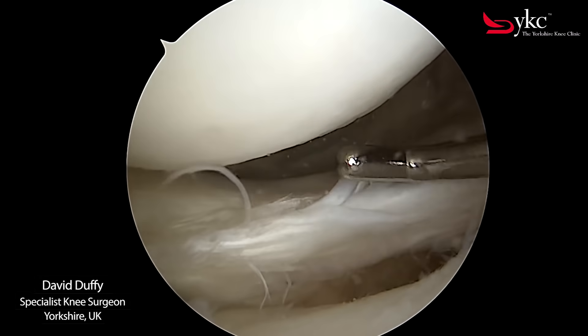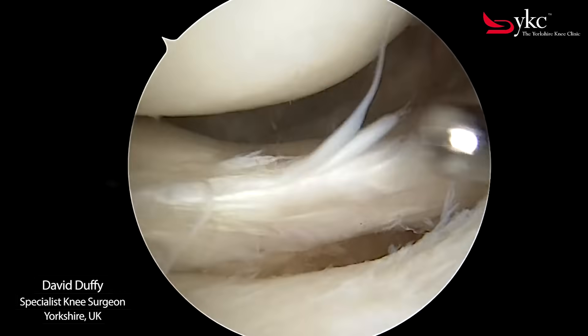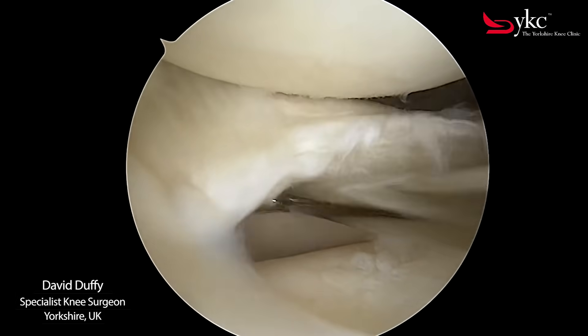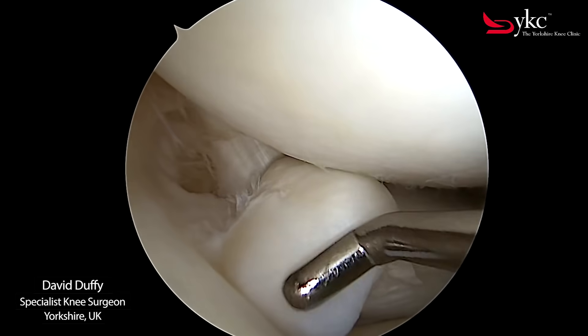During this operation I have found that the edge of the meniscus is frayed. A split or tear becomes visible when probed. Moving further round I identify an even bigger tear with a loose flap of tissue becoming displaced.